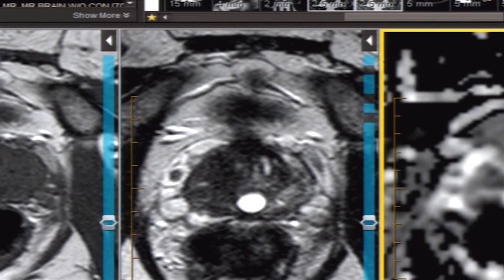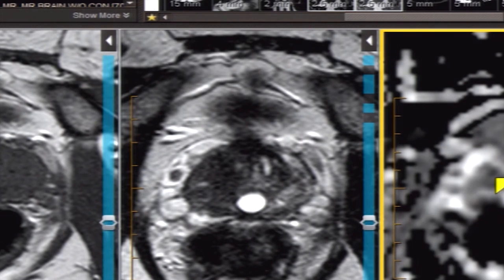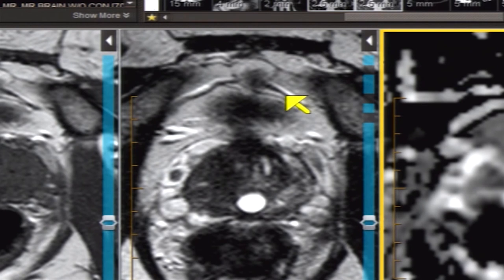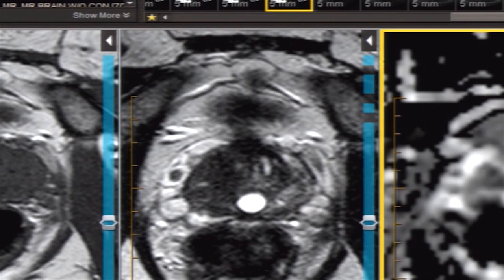The ADC map shows a darker area corresponding to restriction of motion of fluid in the prostate gland, measured in square millimeters per second. My intention is to get you in the habit of comparing the T2 water-weighted sequence with the diffusion-weighted sequence, because this is the heart, soul, and guts of prostate MRI — unlike breast imaging where DCE MRI holds that role. DCE MRI is used in prostate but it's not the primary sequence.